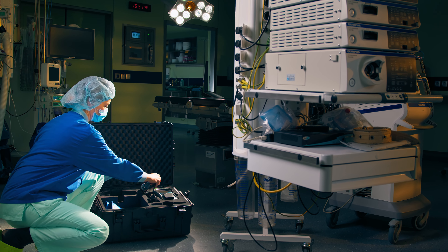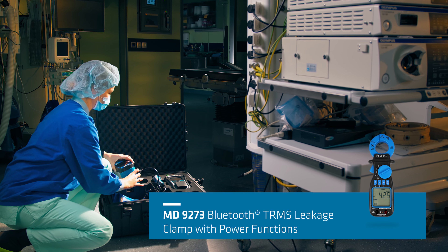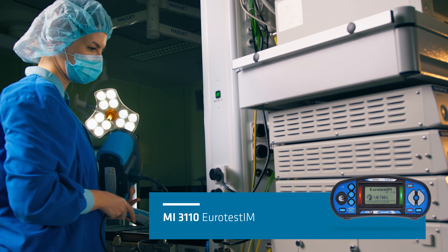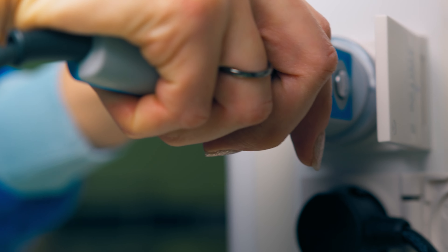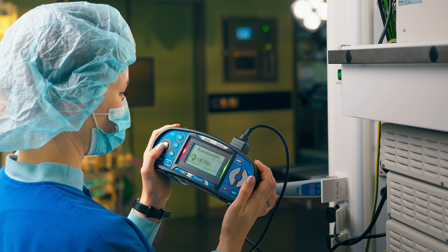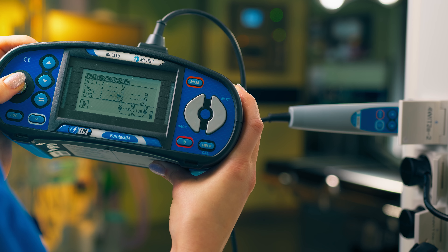We have designed a testing kit that consists of the MD9273 leakage clamp meter and the MI3110 Eurotest IM. Hospital operating rooms are equipped with many complex electronic devices and require more comprehensive electrical safety testing of their electrical installations.